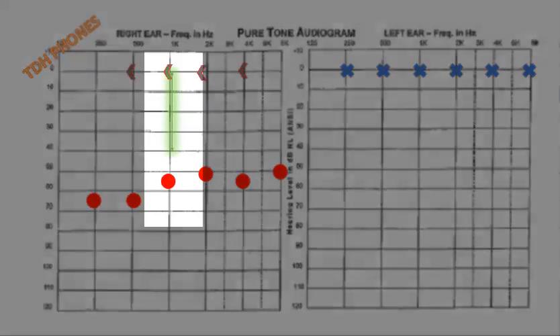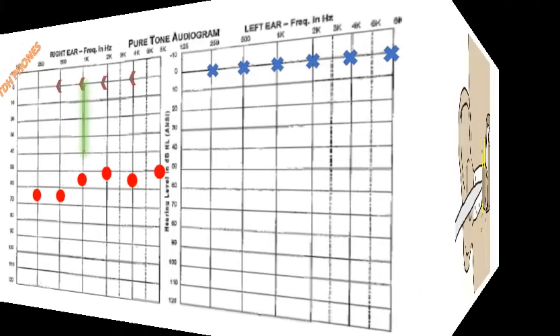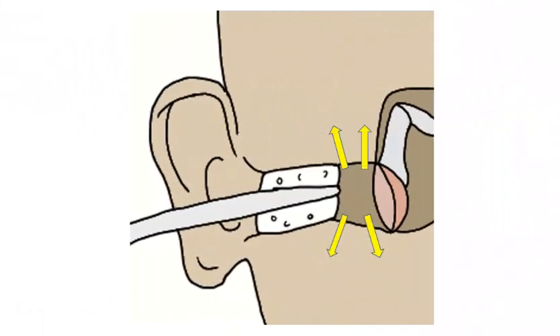How is that possible? If the IA indicates the point when test signals might enter the cranial bones, shouldn't the subject have responded at lower dB HL levels for the right air conduction signals? In other words, at levels that are close to the IA value? The 1000 Hz attenuation value is 40 dB. Shouldn't the signals have entered the bone near that point? If the signals can enter the bone, they should be heard by at least one side.